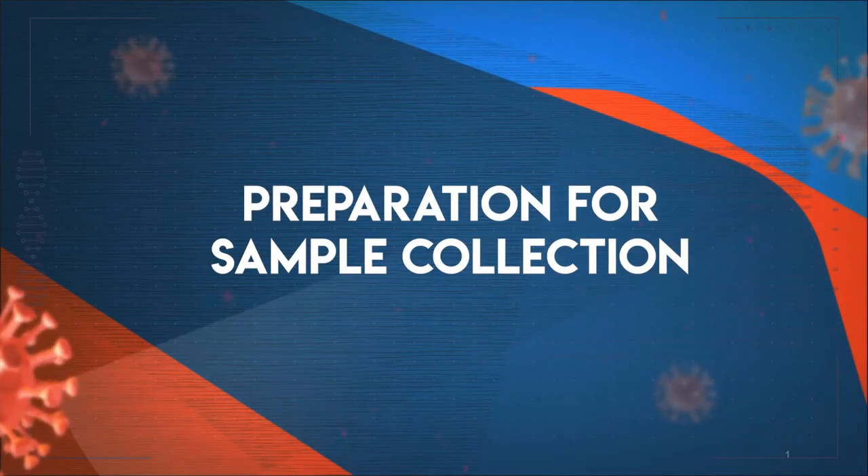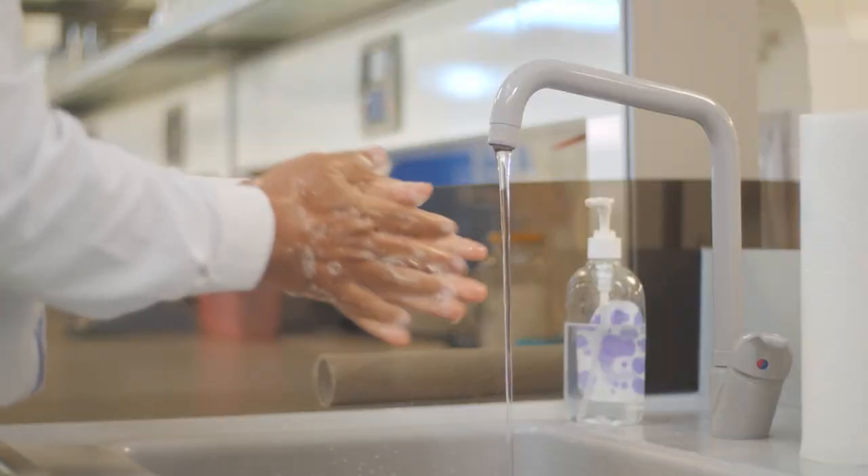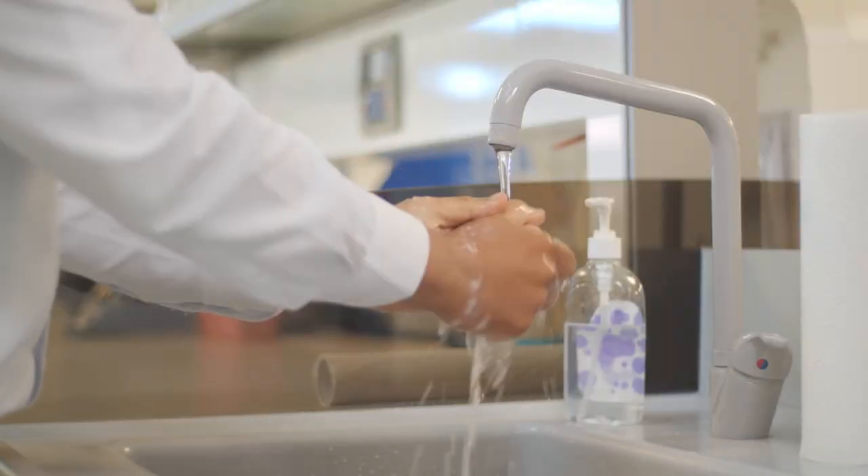Preparation for sample collection. We will start the procedure with hand washing.